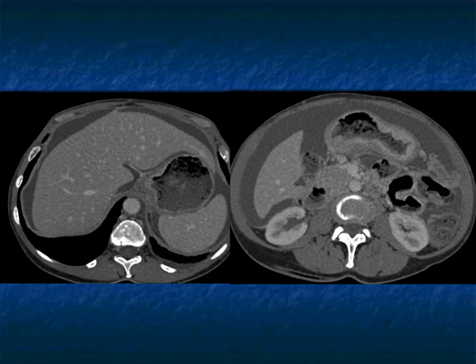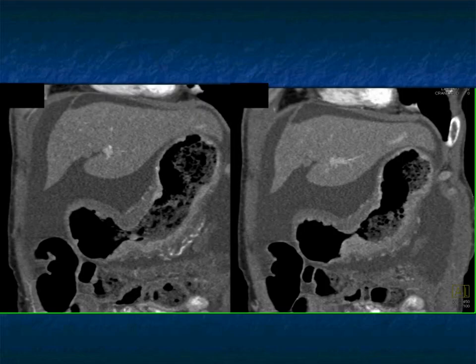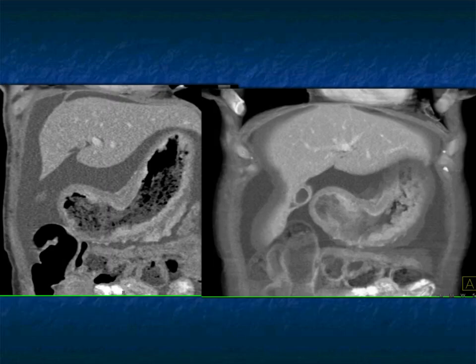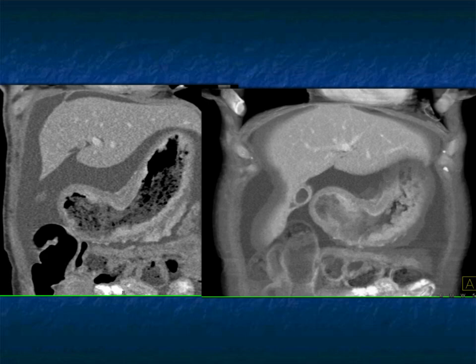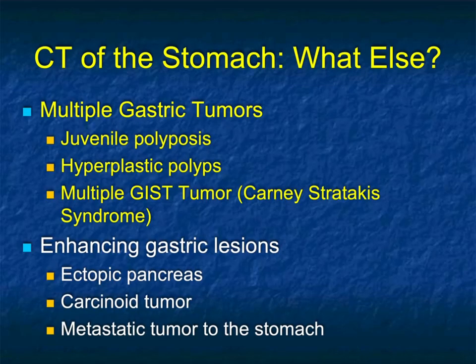Linitis plastica typically involves the entire stomach — the stomach does not distend, the tumor is infiltrating. You can get linitis very focal, but most of the time it involves nearly the entire stomach. Here's a very nice 3D view and volume-rendered view showing the coronal plane with the infiltration. The differential to me is adenocarcinoma versus metastasis. If the patient had breast cancer that would help me. Linitis plastica is classically metastatic breast cancer, but it's also one of the appearances of gastric adenocarcinoma.